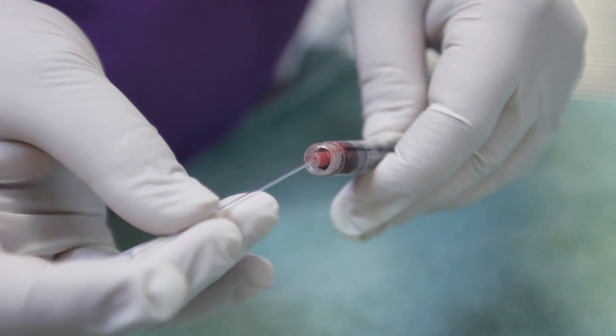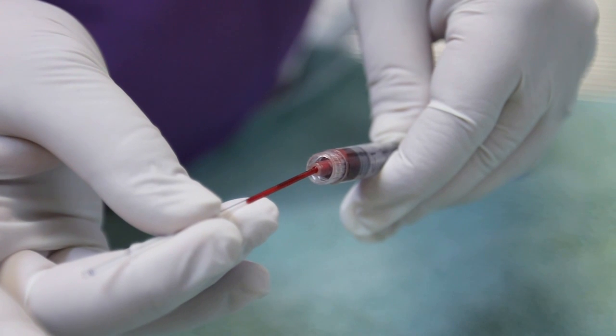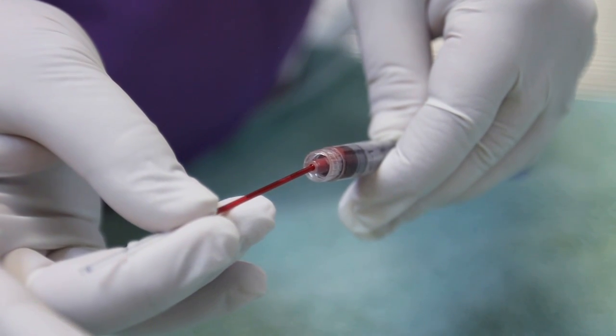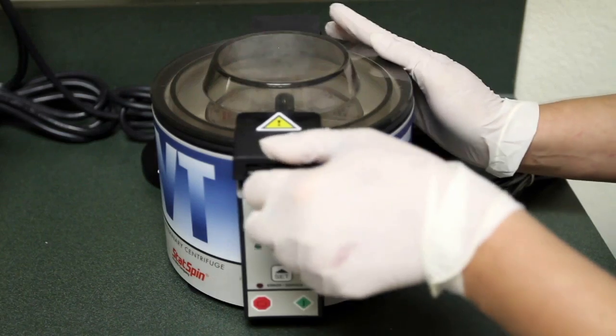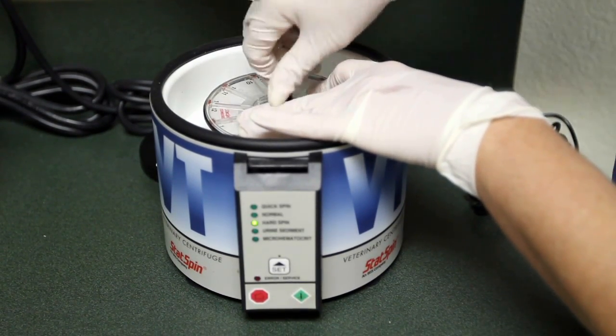Protein concentrations are often measured by evaluating a drop of serum from the plasma portion of blood in a hematocrit tube. This protein value gives the clinician significant information in helping to determine the patient's hydration or other disease conditions.